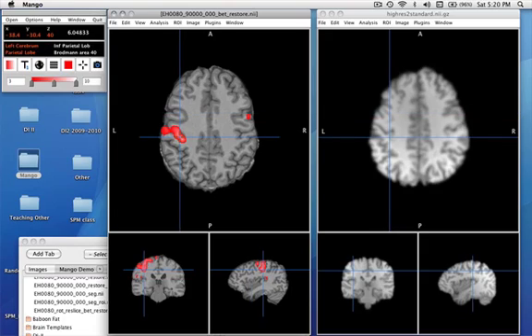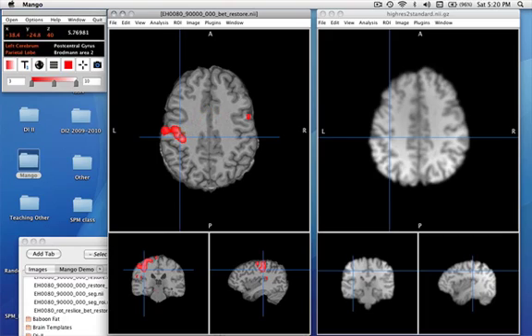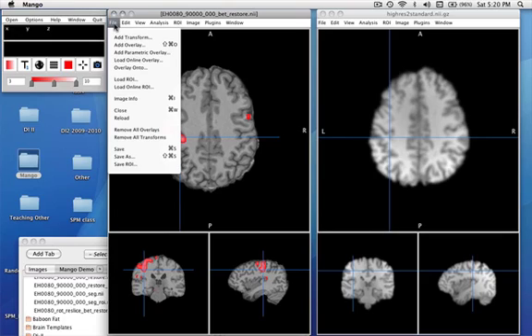And now we can see in the higher resolution image, an overlay from a different person placed at, in front, with data that was acquired at worse than two millimeter resolution, probably two and a half to three, now being displayed on a 0.8 millimeter high resolution image. So nice feature of working in coordinate mode.